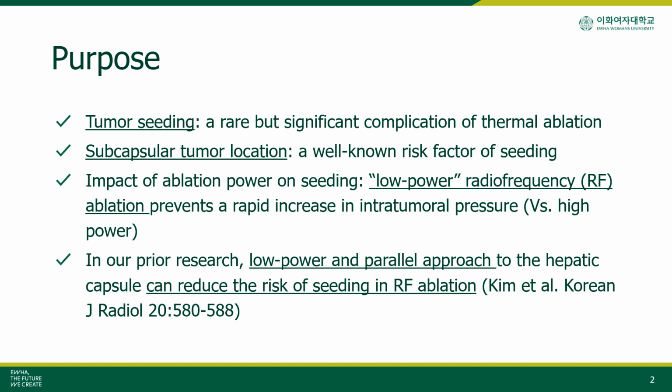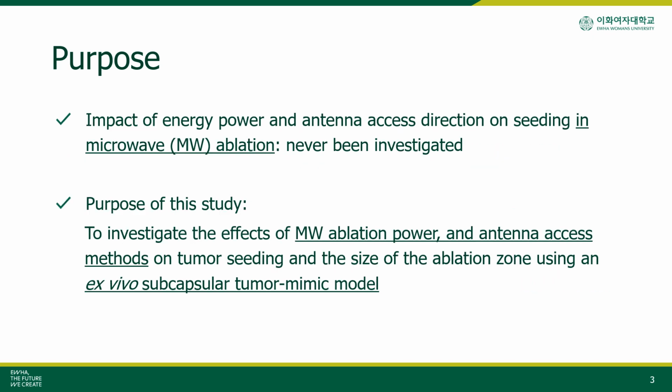Previously, our research group revealed that adopting a low power protocol and a parallel approach to the hepatic capsule effectively reduced the risk of tumor seeding. However, no previous studies have investigated how energy power and antenna access direction affect seeding incidence after microwave ablation of subcapsular tumors. Therefore, this study aimed to investigate the effect of microwave power and antenna access method on tumor seeding and ablation zone size using an ex vivo subcapsular tumor mimic model.